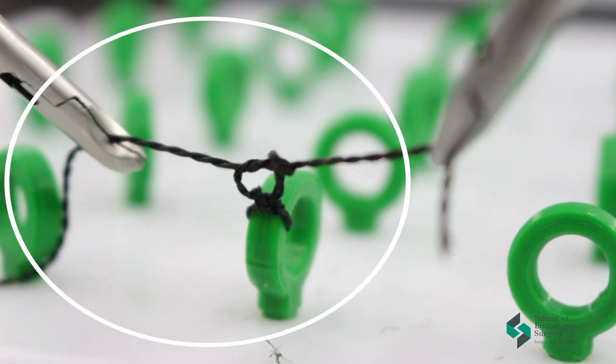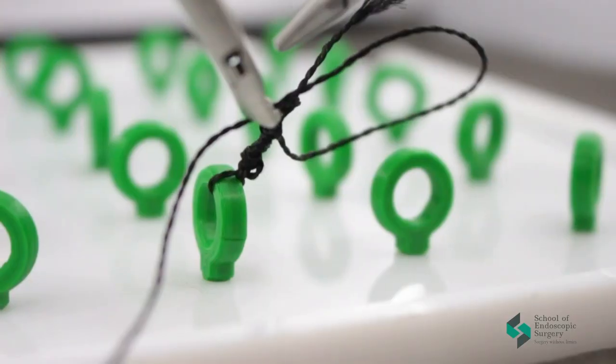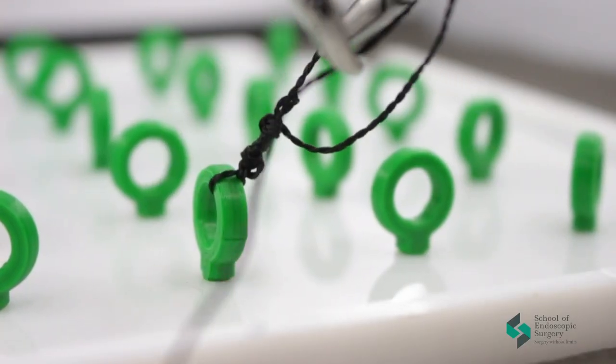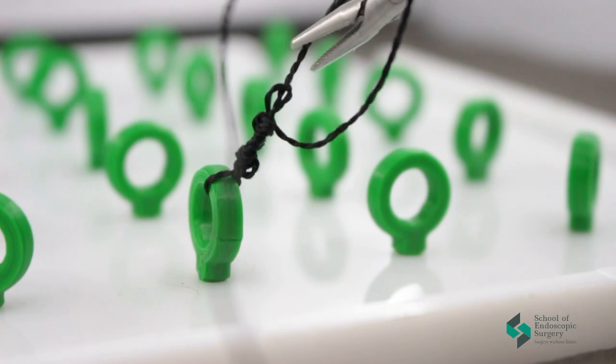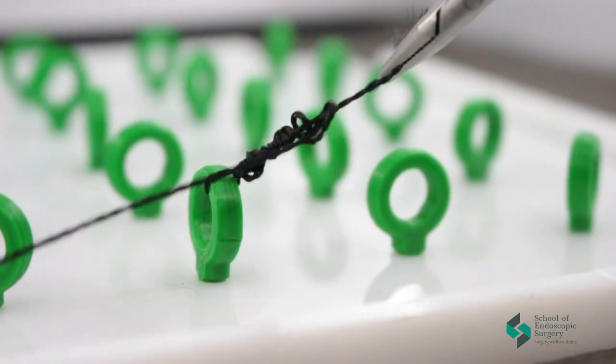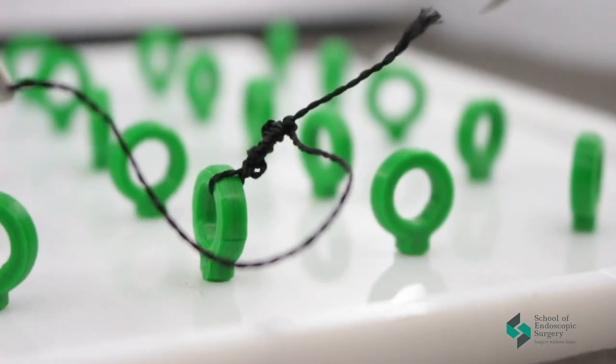Try to form one or two thousand knots each day. Every day you will notice new nuances that you need to improve more and more. The main goal is to learn how to form endoscopic knots quickly and accurately.